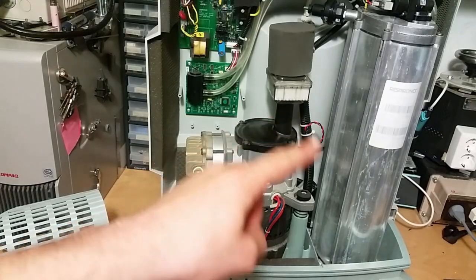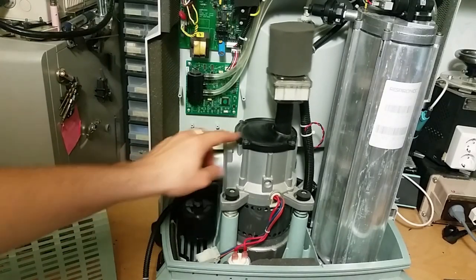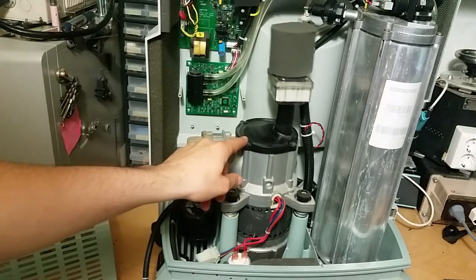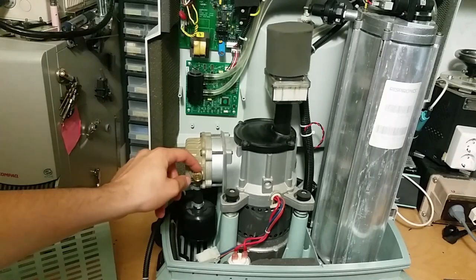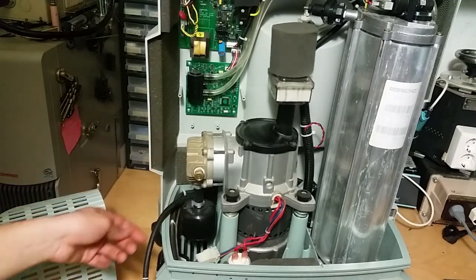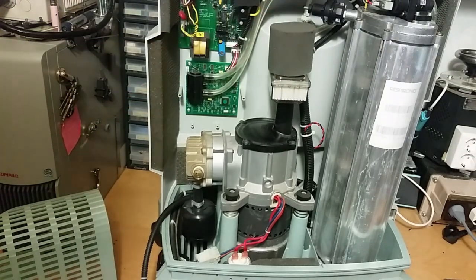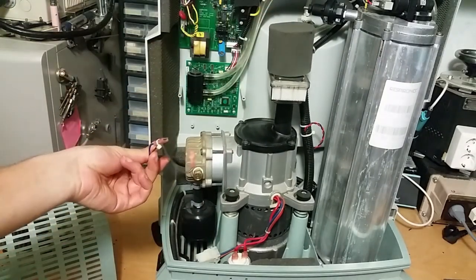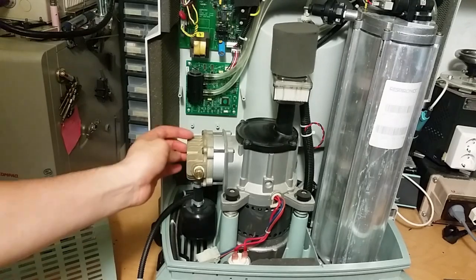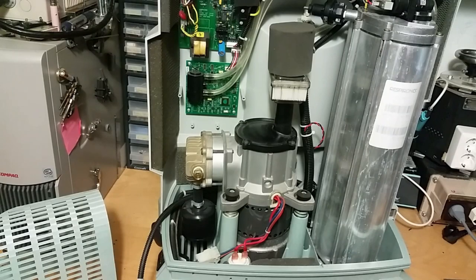Now I remove the complete compressor housing, which reveals the compressor sitting on its springs. That's very nicely made — the springs take away all the vibrations from the compressor. The compressor has its start capacitor down here. The shaded pole motor drives the squirrel cage fan, which blows air over the cooling fins, because the compressor gets pretty warm when it compresses the air.